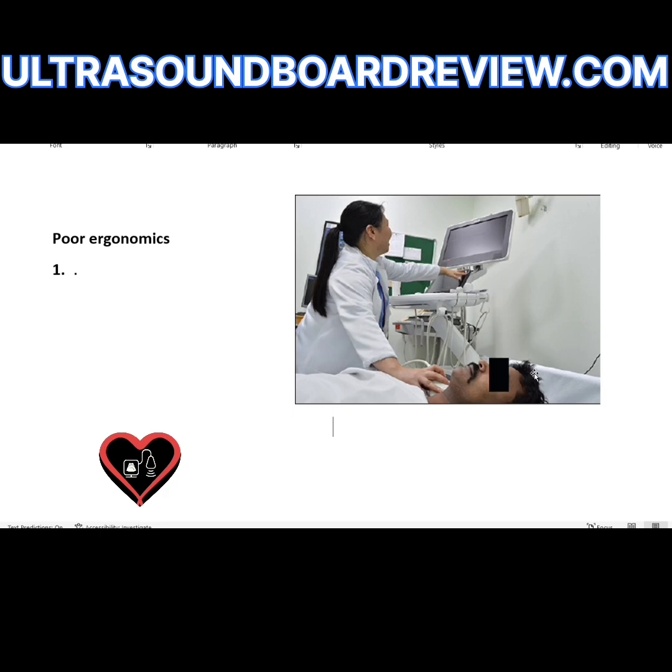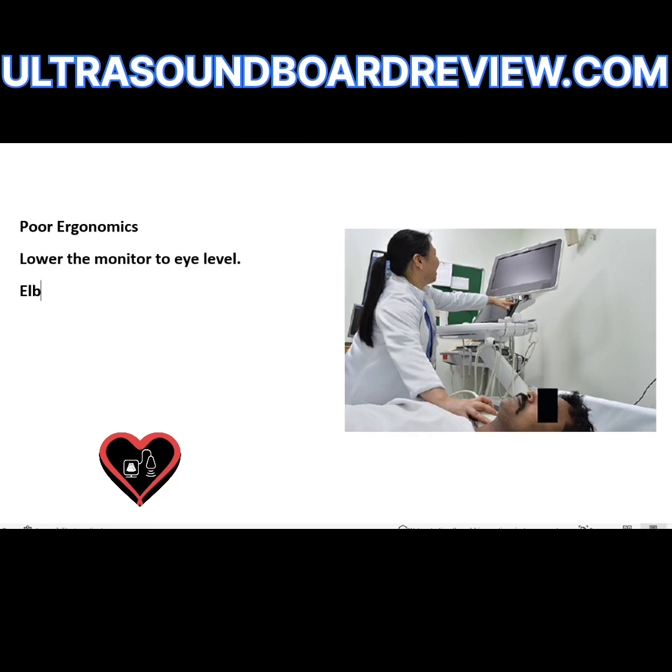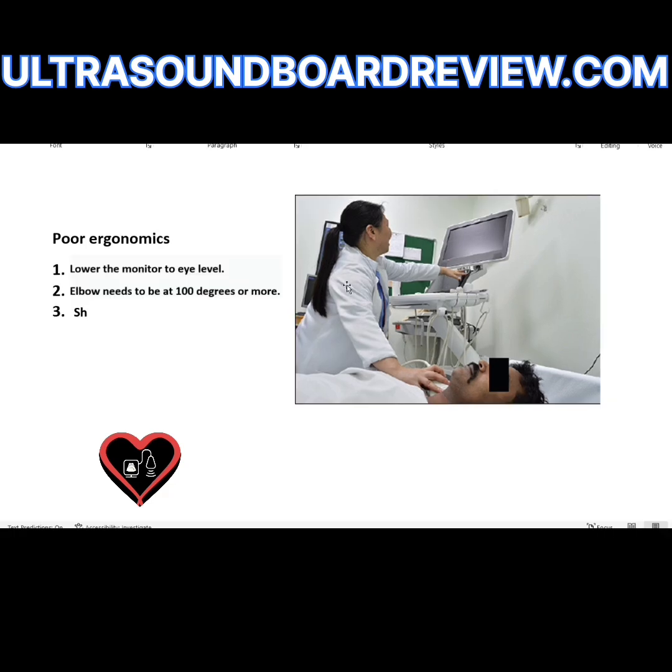How do we fix this position? Lower the monitor to eye level. The elbow needs to be at 100 degrees or more. Here's how you know her shoulder angle is greater than 30 degrees — look how she's leaning to the right. If you're leaning, then you're obviously going to have an extended arm. The shoulder needs to be at 30 degrees or less.